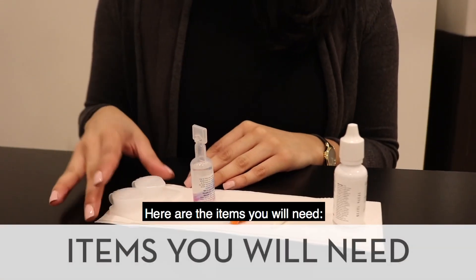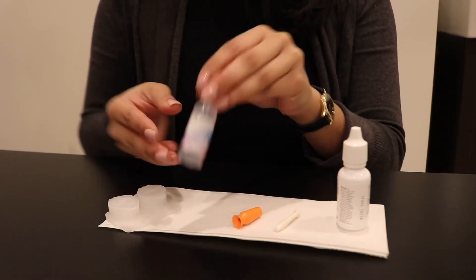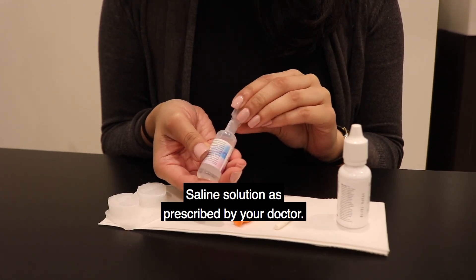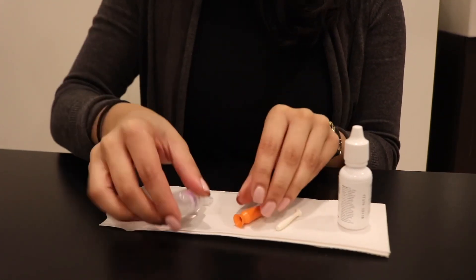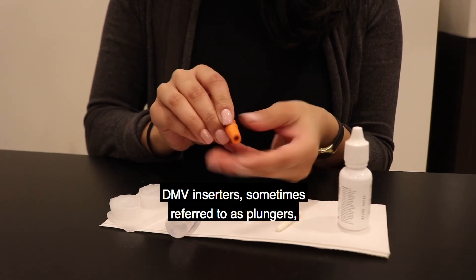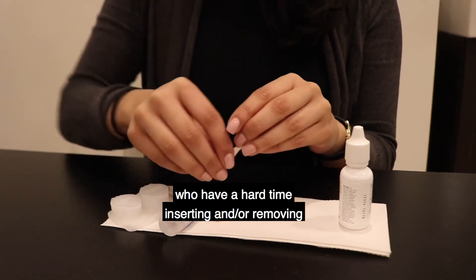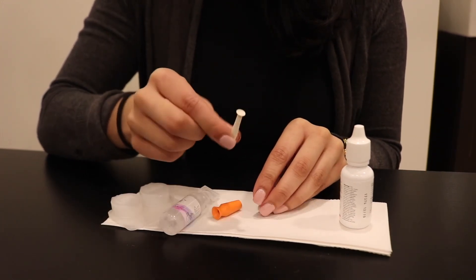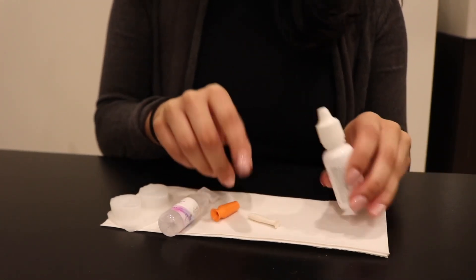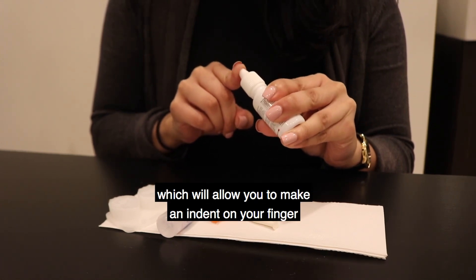Here are the items you will need: a contact lens case, saline solution as prescribed by your doctor, DMV inserters — sometimes referred to as plungers — which are used by scleral lens patients who have a hard time inserting and or removing the contacts with their finger, and a bottle with a flat cap which will allow you to make an indent on your finger to better hold the lens.